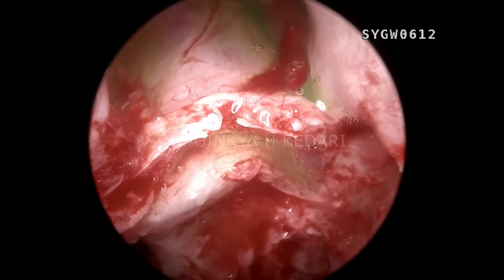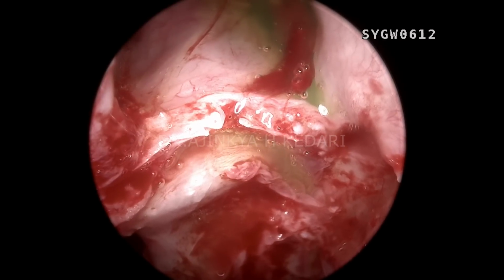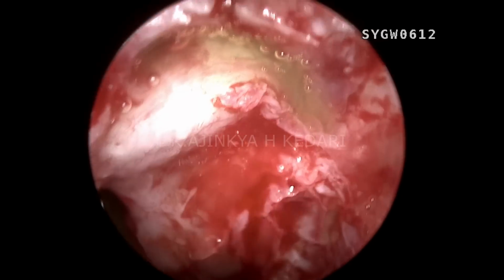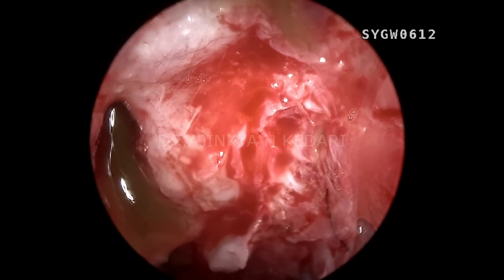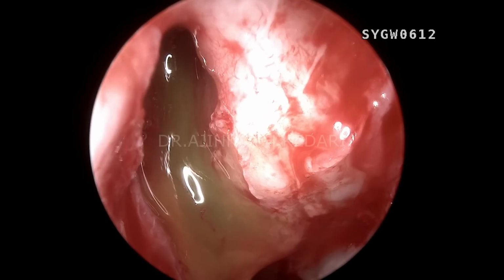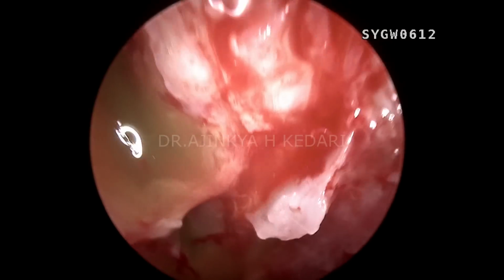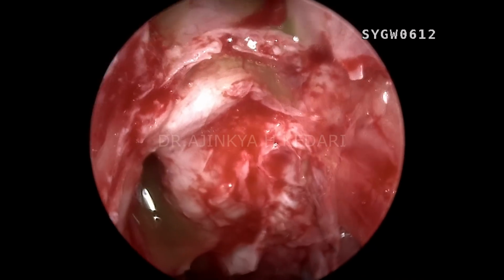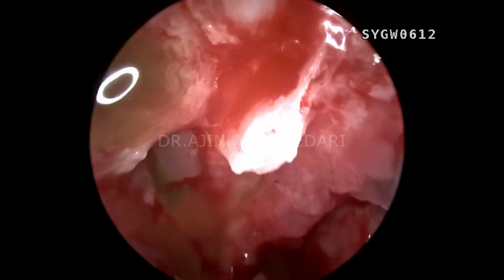I'm not going to go external and do a transfrontal procedure by the external method. I'm purely going to go endonasal, because this patient, as already discussed, has been operated on twice by the neurosurgeons out there, and twice by the transcranial method to no avail. So you can see that's the second site of the CSF leak, with active CSF pouring from a defect up there. And you can see there's no communication between the first and the second possible CSF site.